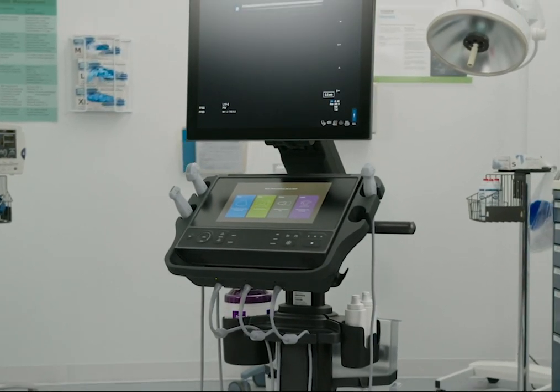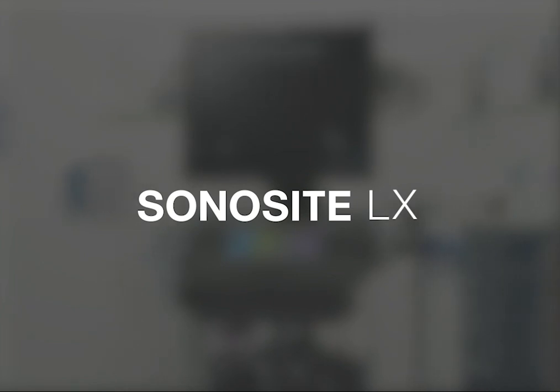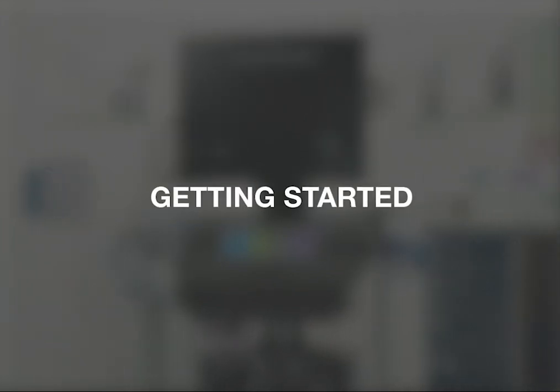Welcome to the Sonosite LX, our high-end kiosk system designed to be portable, fast, and support both procedural and diagnostic needs. In this video, we'll show you how to start using the system.